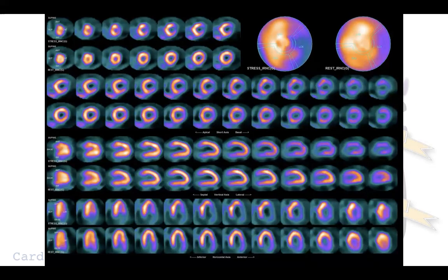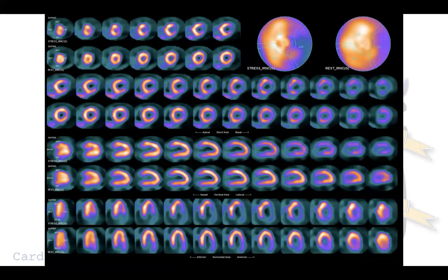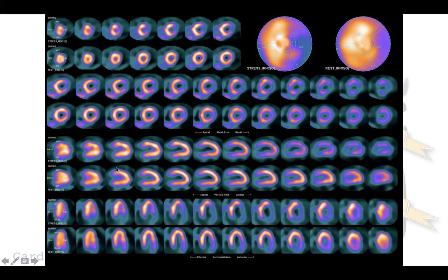Here we have the final results of the scan. In order to read the myocardial perfusion scintigraphy, you need to know that we acquire two different types of scan — after stress and at rest — and we need to compare each slice in the two different conditions to evaluate perfusion abnormalities. We have three different types of slices: the short axis from apex to mitral plane, the vertical long axis from septal to lateral wall, and the horizontal long axis from inferior to anterior wall.